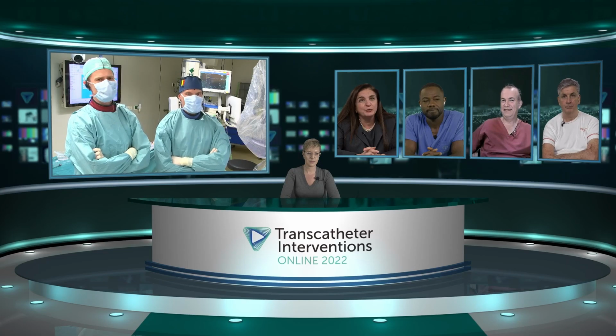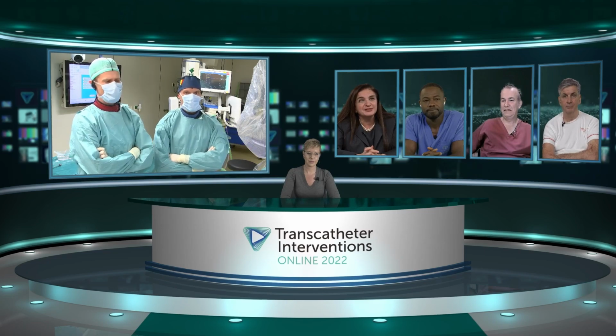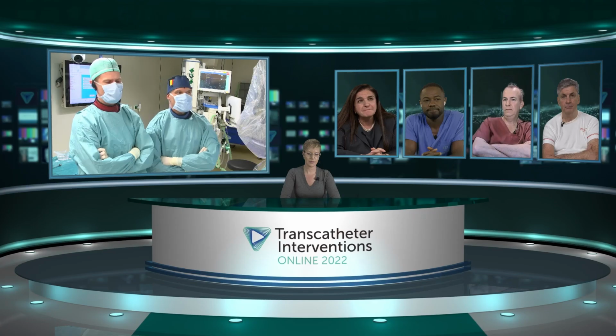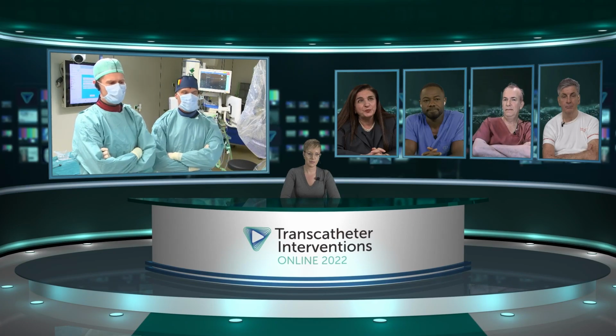And then, of course, if worse comes to worse, a direct aortic approach is yet another. But I think we would probably see if we could still do the right femoral on the right side. There is also a severe tortuosity, so you'd have to deal with that as well, as perhaps using shockwave to navigate your way in.